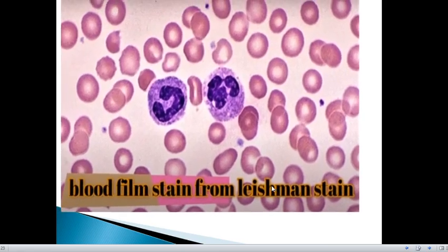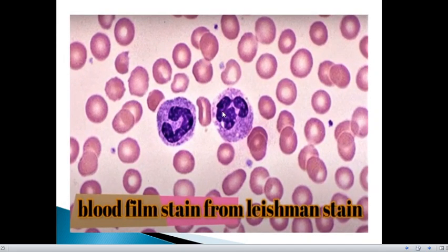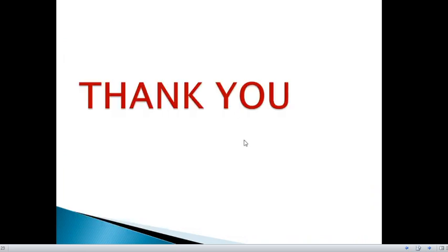This is how a good Leishman stain solution will look on a peripheral smear. I hope you have understood the procedure. Thank you.